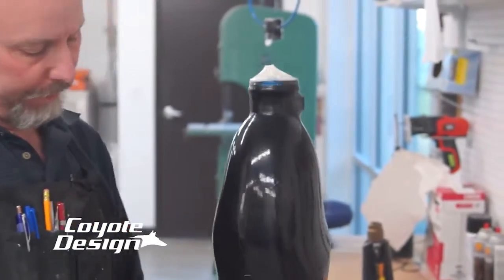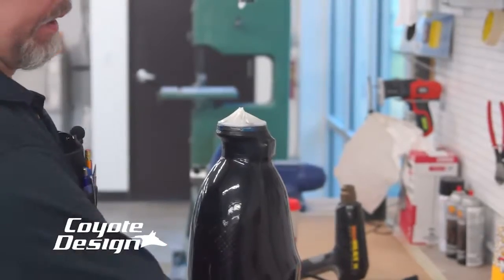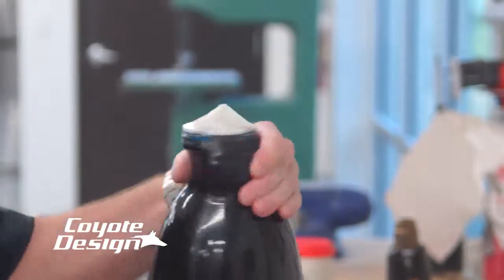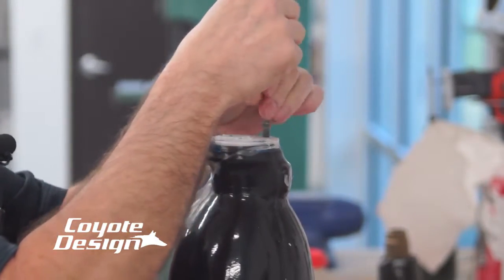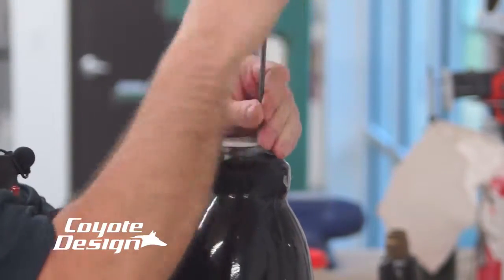We're done laminating and getting ready to cut it out. I'm going to take off my lamination plate, put on my pulling tool, cut it out, and pull the socket out of the cast. The one thing we did to make sure on this was letting it sit overnight so this epoxy resin would bond to the surlyn.